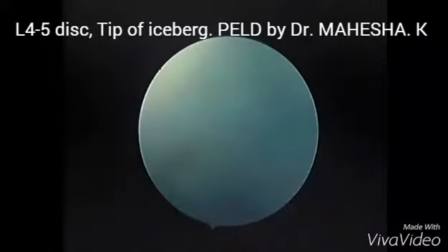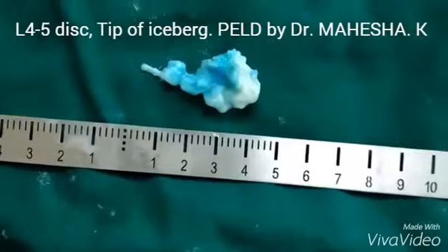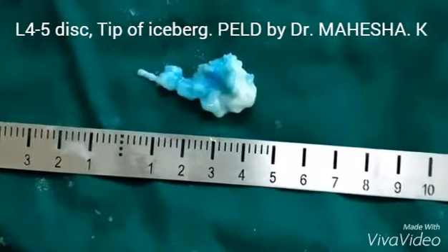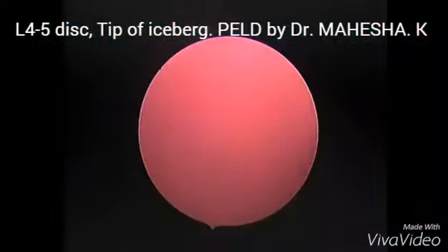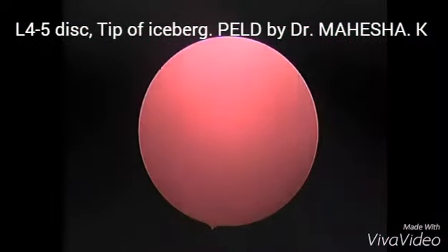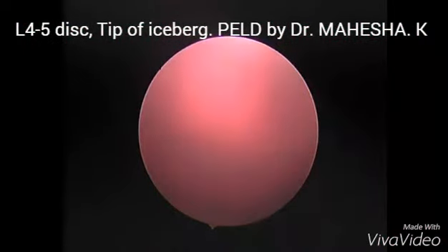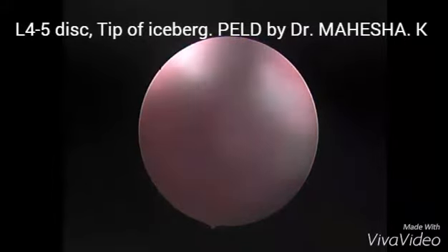You can see the size of the fragment, which is about 4 by 0.5 cm in size. When we go in again, you can see the epidural bleeding, which again confirms that it is the herniated fragment.